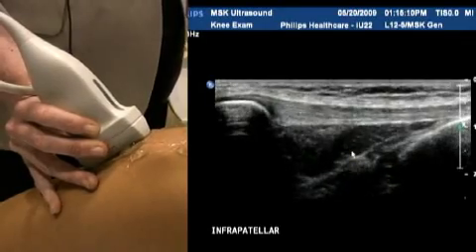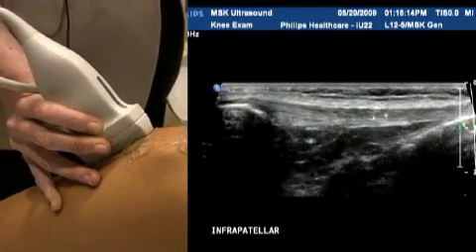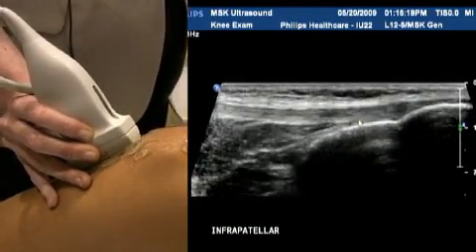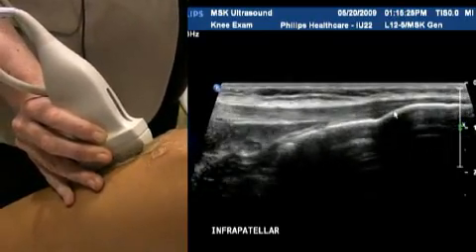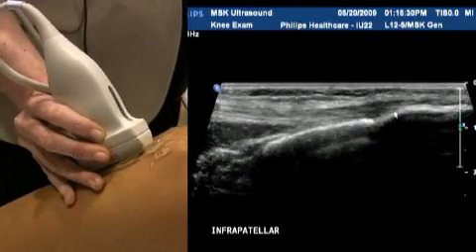With the 12 megahertz transducer we can almost get the entire length of the tendon, which is quite long. At its distal attachment you can see it fans out as it attaches distally. So it's really important to make sure you scan medially to laterally and cover that entire distal attachment portion.